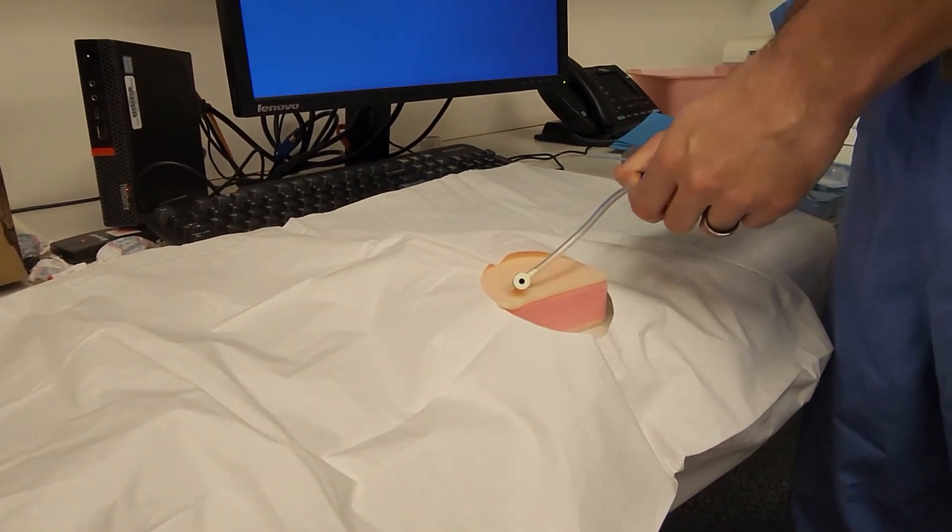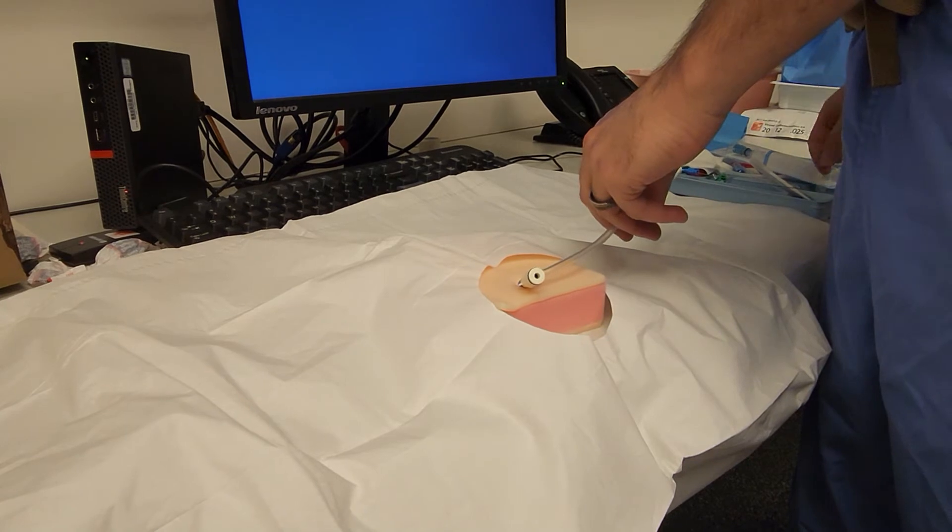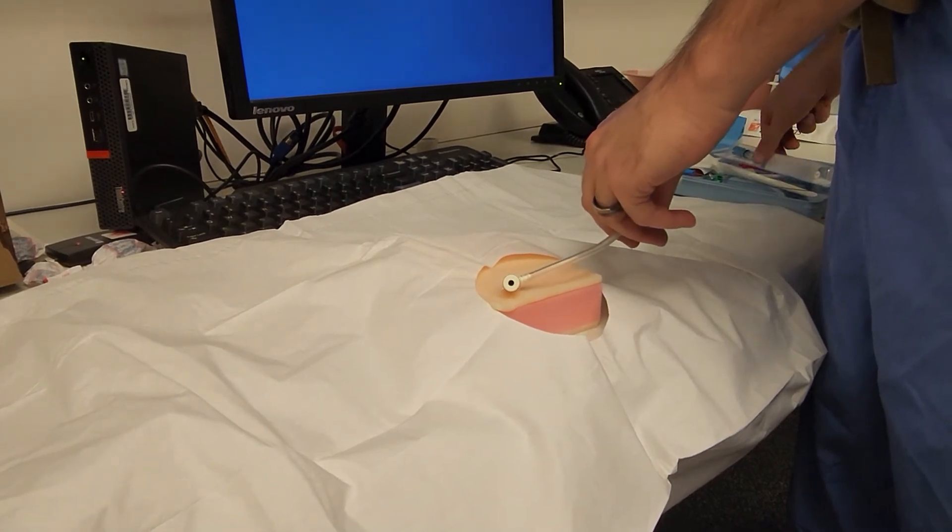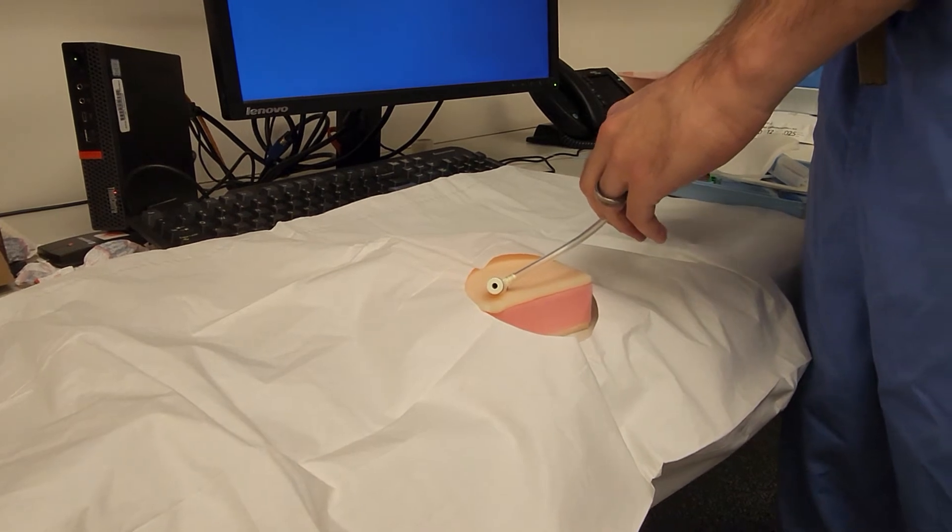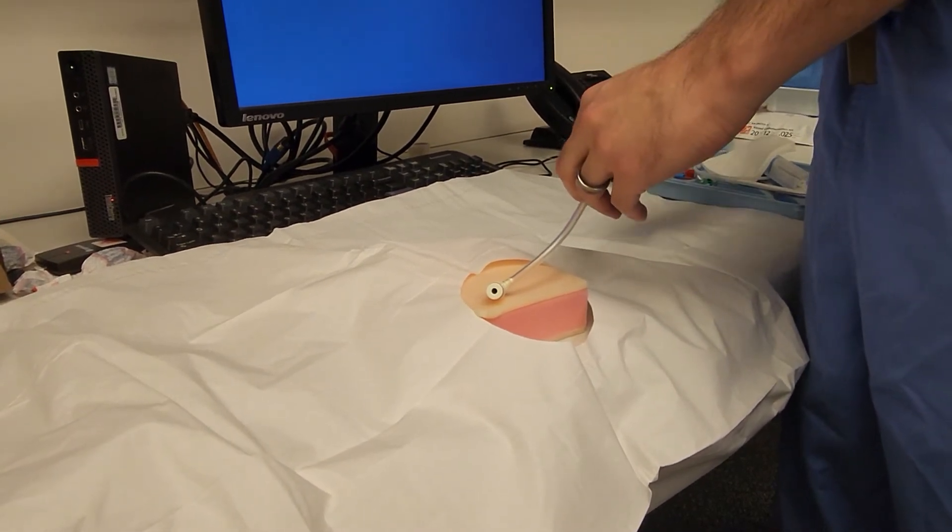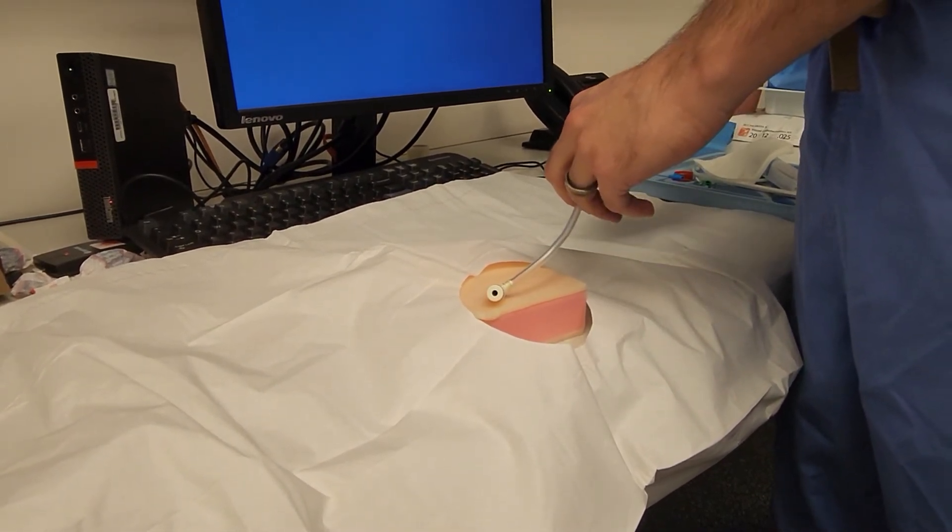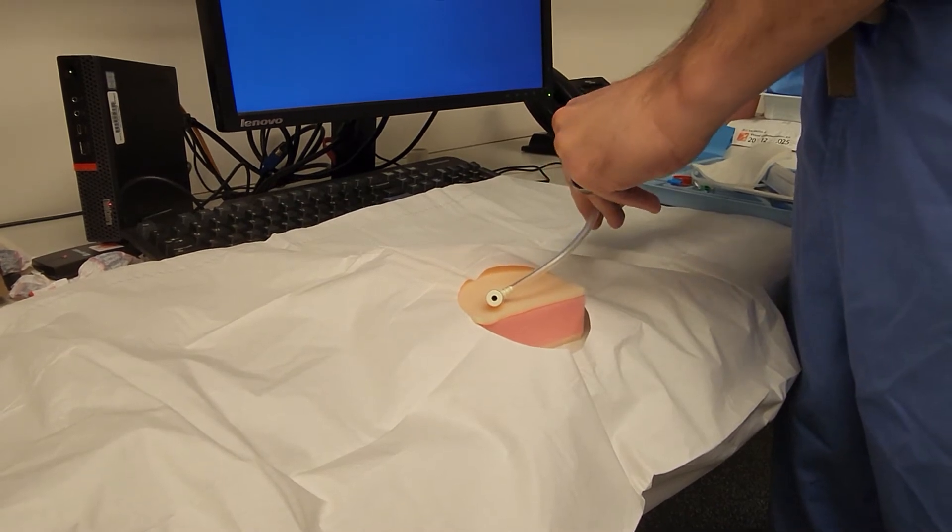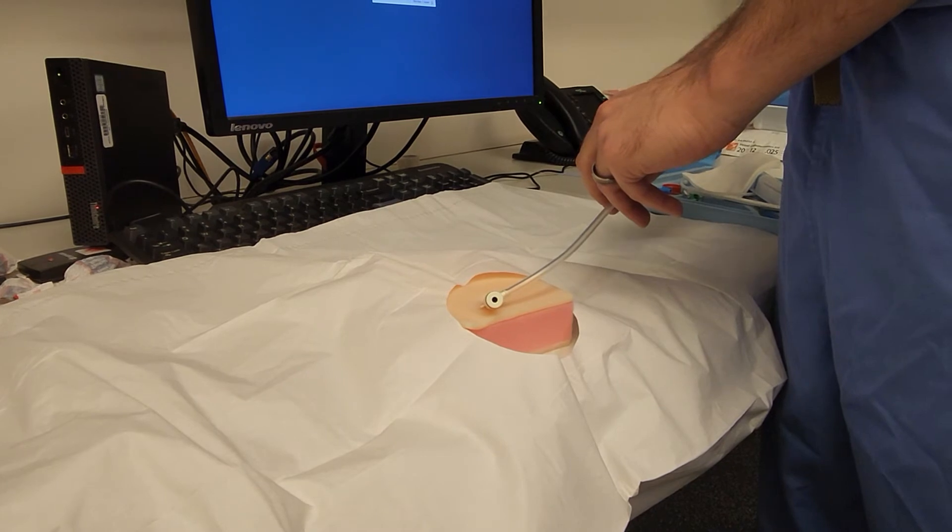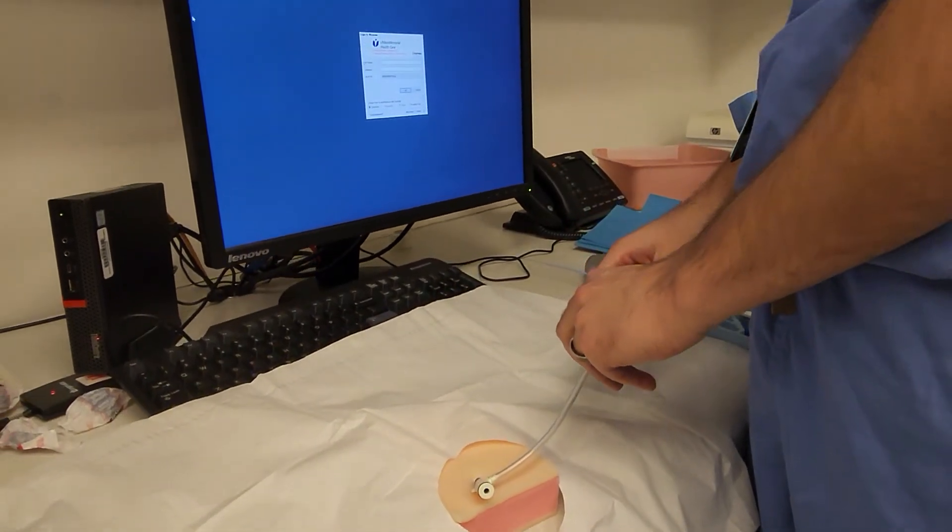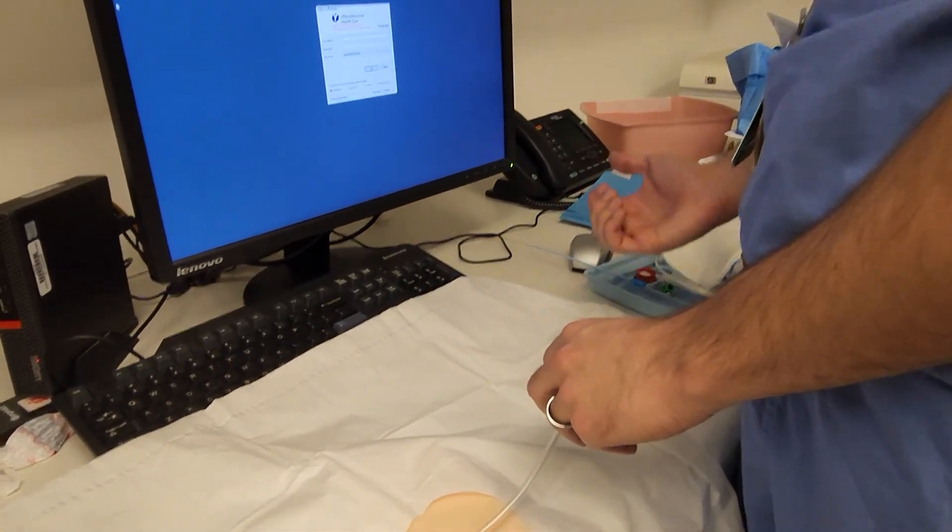Release your clamp. And actually before releasing the clamp, make sure you attach a luer lock to the end or blood will go everywhere. So I have a luer lock here. You can release, aspirate, and make sure it aspirates blood freely. And then flush it.